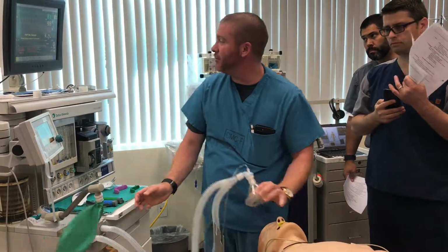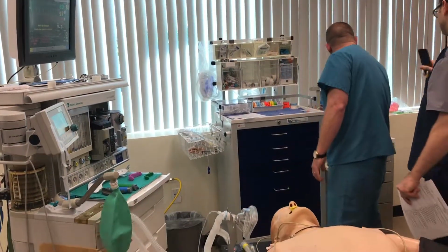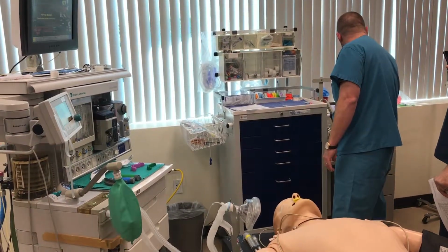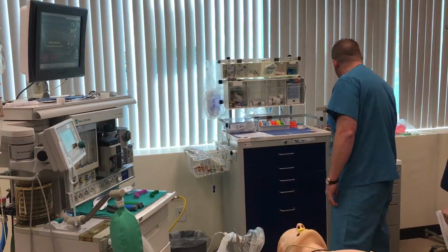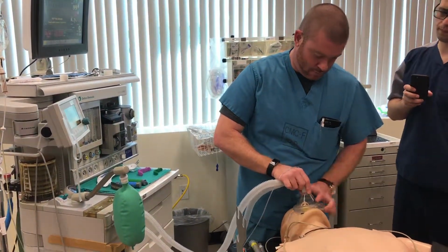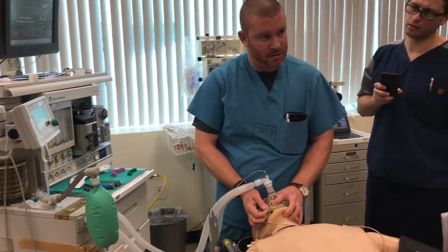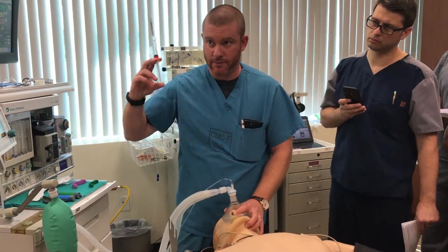But we're going to say that we established ventilation, and what you would see with the ventilation is his respirations come back. I'm doing it myself right now. So I've established that I can ventilate him. What am I going to do? What's my next step? Muscle relaxant.